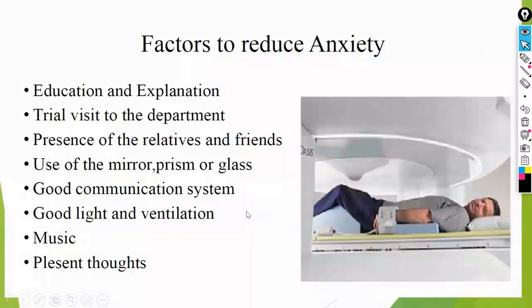Open MRI is definitely better. Yes, it is available, but there are some cases where it won't be suitable for you. I mean, you are an open MRI candidate, but you will find, doctor, that the homogeneity of the magnetic field means that you cannot perform the measurements on it.